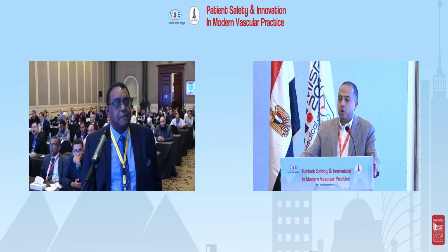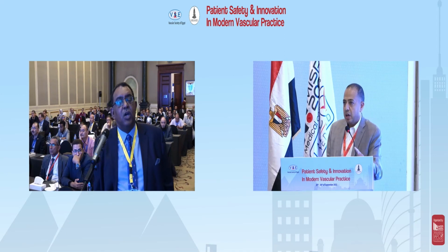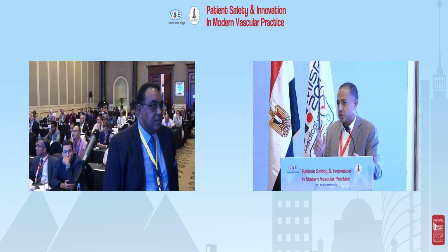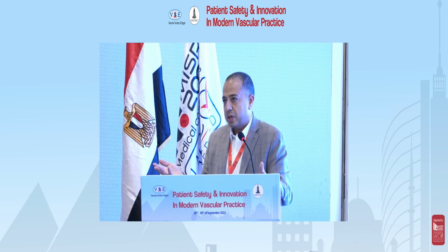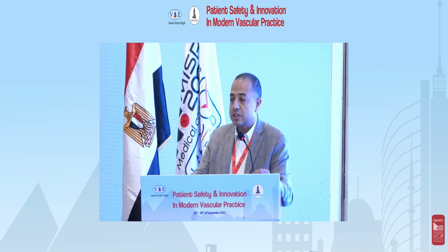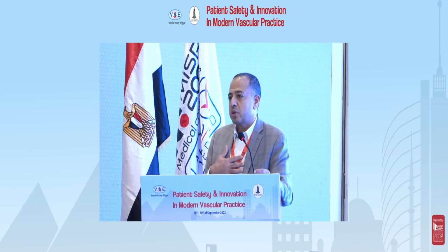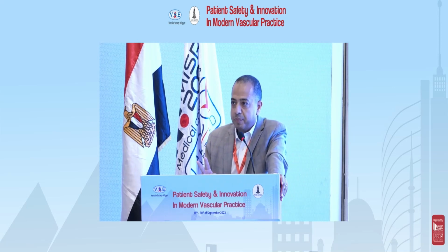I don't compare it to IVUS. I'm considering them complementary to each other. And if the question is about CO2 angiography compared to conventional angiography, there is growing evidence that we might use it, and it has a good sensitivity in detecting endoleaks. But talking about myself, frankly, this was my first case to do both of them.